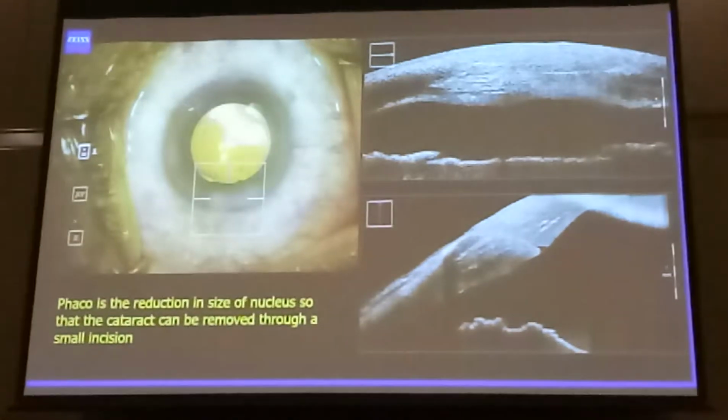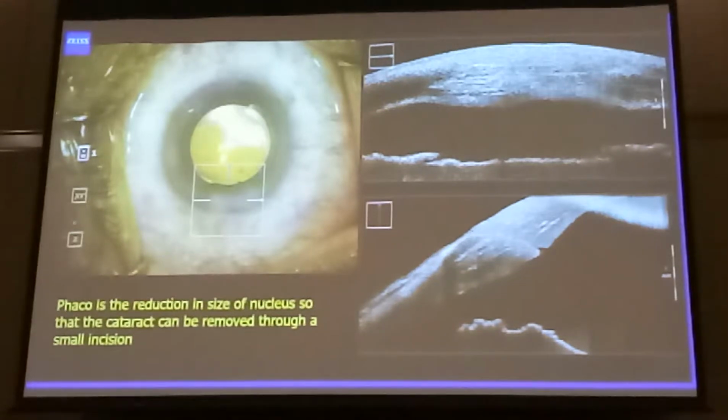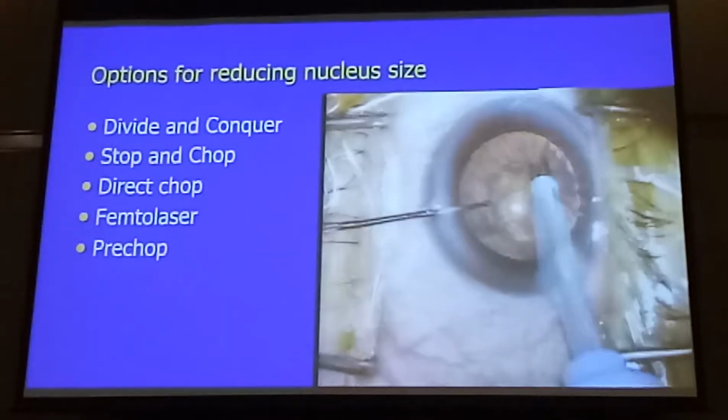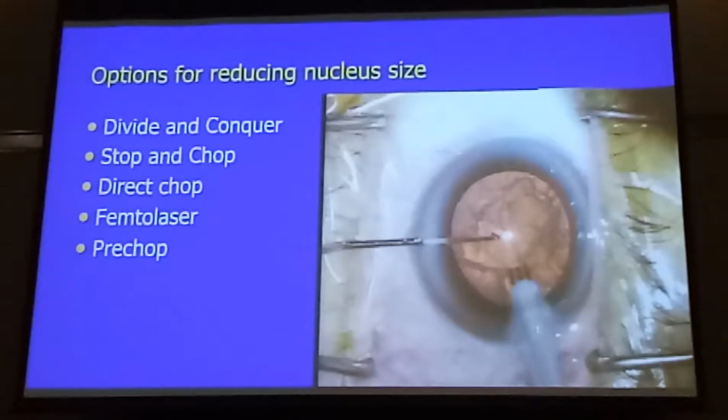So, if you think about phaco in that sense, all we're trying to do is to reduce the size of the nucleus into small pieces so that the cataract can be removed through a small incision like that, and the lens going in through that same small incision. Here again you can see the main incision, how well sealed it is, on OCT. Of course you can remove the cataracts through a small manual small incision cataract surgery. You get the whole nucleus out, but that's not small enough. We really want to have 2.4 or 2.7 millimeter incisions.